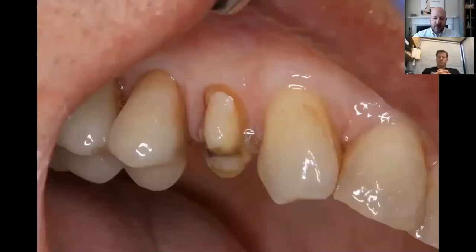Here's our final prep. This is a chamfer prep just at or slightly subgingival. I used an 856-type diamond. I tend to do a lot of rounded margins because we do scanning in the office, and the best research shows that scannable margins are more of that rounded margin type. In this particular case, retention and resistance form was an important aspect. Most reduction was already done from removing the old PFM, but cleaning it up and getting rid of the decay was the focus.